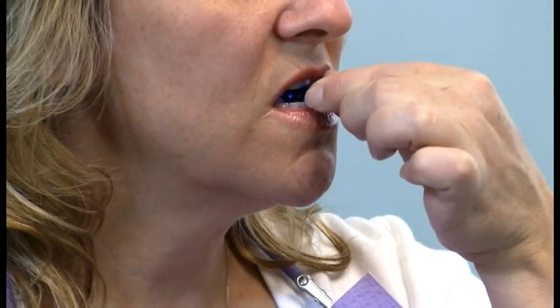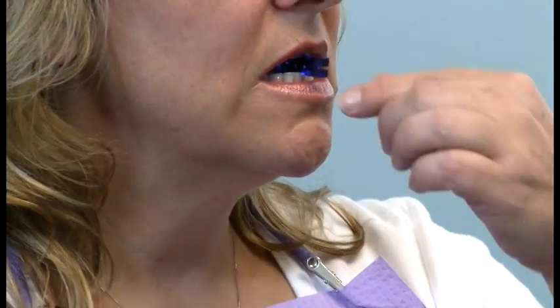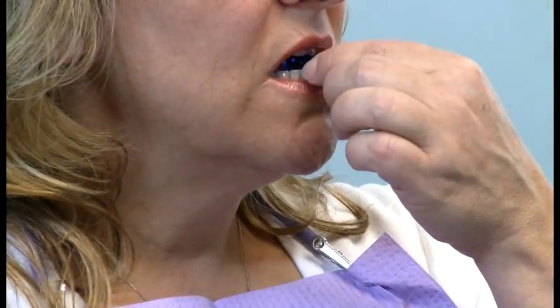So let's now go to the 6 millimeter, 2 millimeters forward. So now her mandible is 2 millimeters forward, and when I hand these to her, if the number 2 notch is pointing toward her, when she turns around and puts that into her mouth, she's going to be in 2 millimeter anterior. Okay, let's have a breath and tell us what you're feeling. I would say that's a 5. That's a 5, okay. 2-6 is a 5.